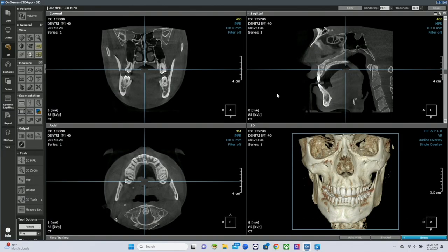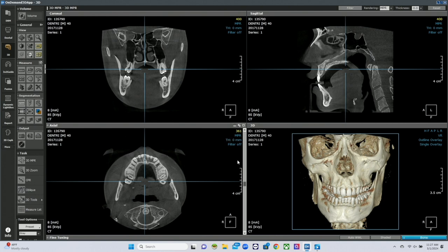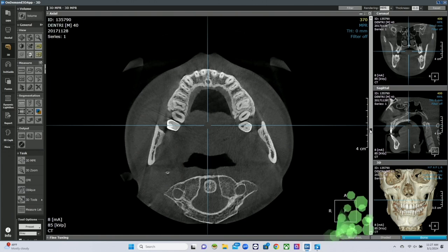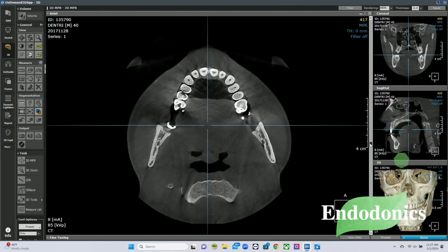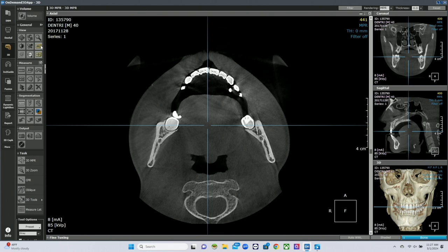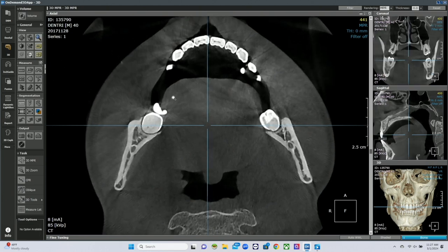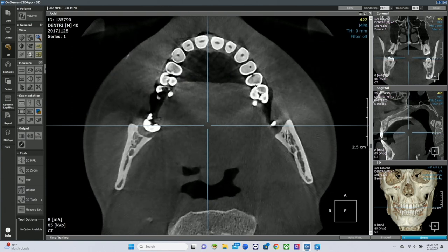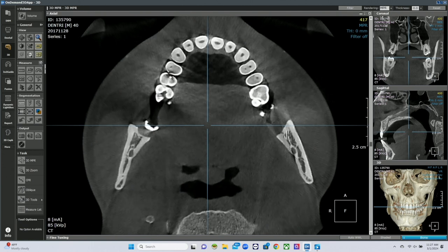Looking at the screen here, going through the easy ones — things like endodontics. If I was looking at this patient and wanted to do an endodontic analysis, I'm in the maxilla and I can go through. With our CBCT from HDX Will, we can actually see things like dental caries, a break in the crown, and how far it's cavitated inside the tooth. We can go through the whole dentition doing an examination and see interproximal cavities along the way.